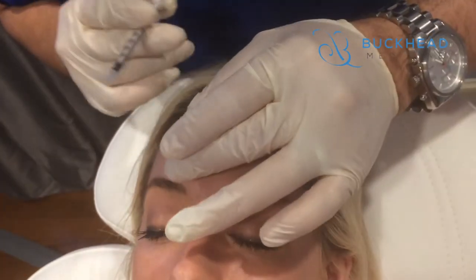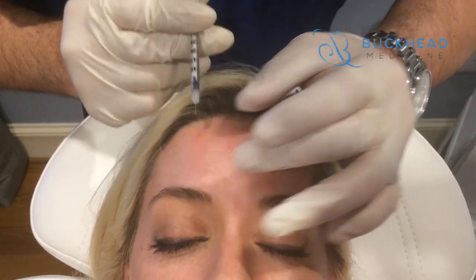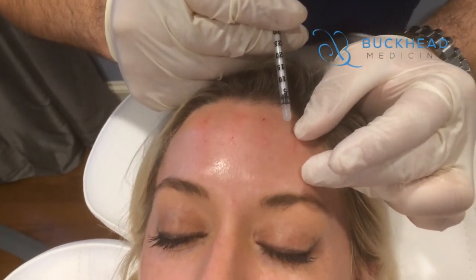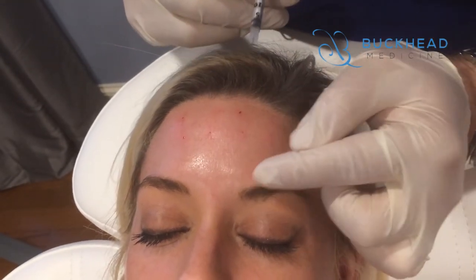Again. Relax. You never really want to get too close to the brows with the frontalis injection, because then you're no longer in the frontalis — you're in the orbicularis or these eye muscles.